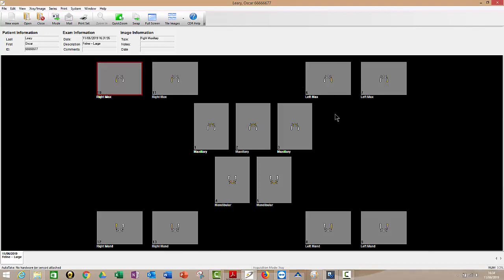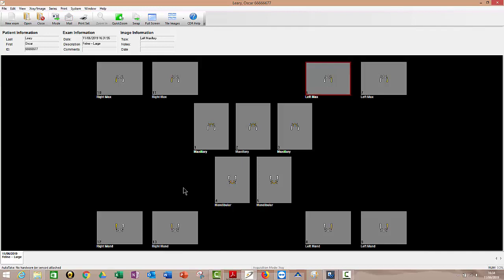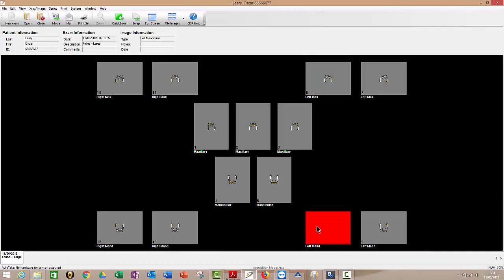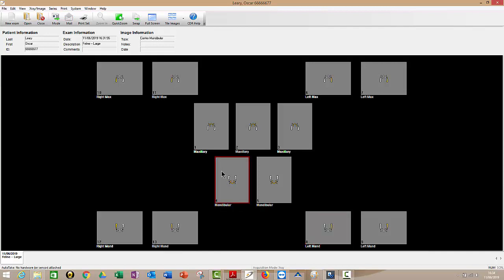Likewise, when I go over to the left maxillary, I will click on six rather than seven for the same reason. And then when I do the lower ones, right mandibular and left mandibular. That gives me the opportunity, if I want to, to do one further forward than the other. So one to get the pre-molars and one to get the molars, for example. And obviously the lower incisors in the same way.